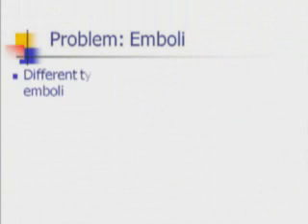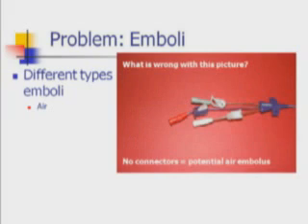An embolus is a mass or foreign object that travels through the bloodstream and may cause serious patient injury or death. Emboli can be comprised of air, catheter or wire, or thrombotic material. Air may enter an IV line during administration of drugs or flushing, when a line is left unclamped, or when there is no needleless connector or an end cap attached to the catheter or stopcocks.